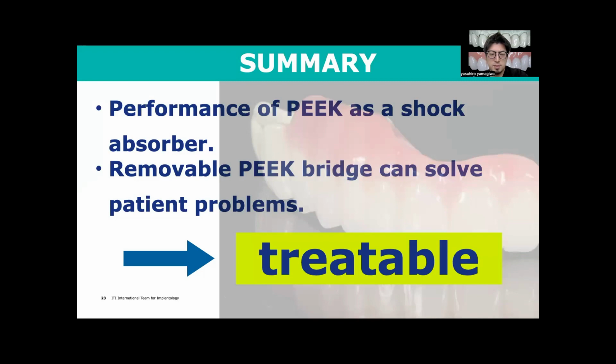In summary, we believe that PEEK's performance as a shock-absorbing material is also effective for custom implant abutments. Also, considering the state of healing of the mucosa, we believe that there is no problem as a material for custom abutments. Removable PEEK bridges can be combined with zirconia internal crowns to provide treatment that increases patient satisfaction, even in situations where implant treatment is difficult.